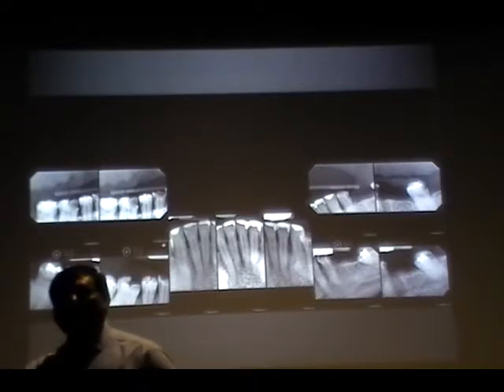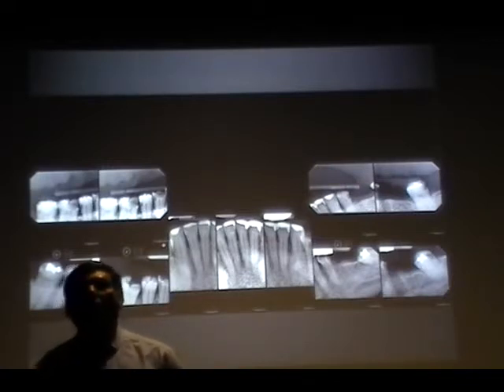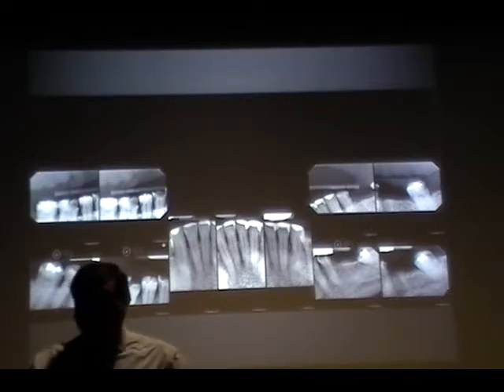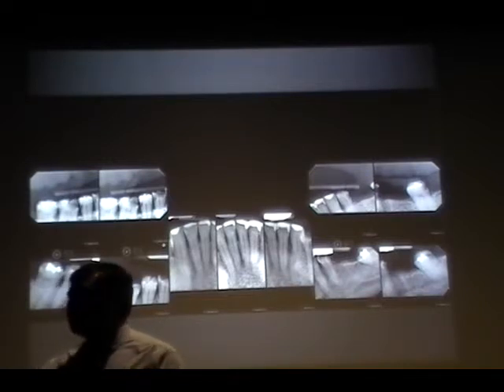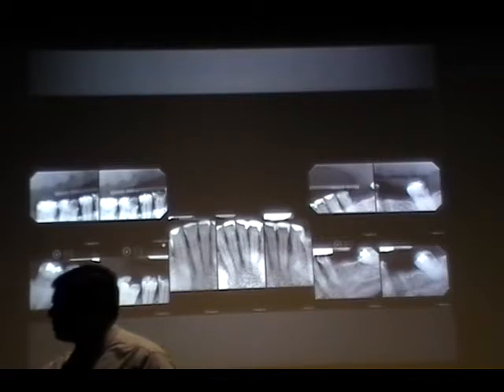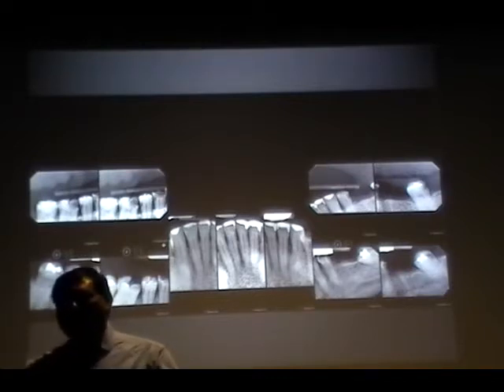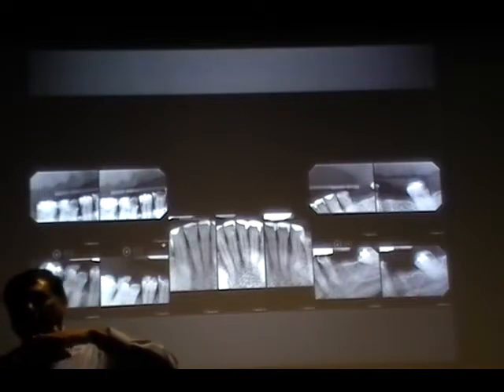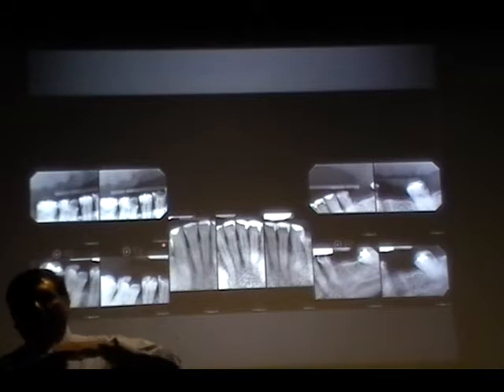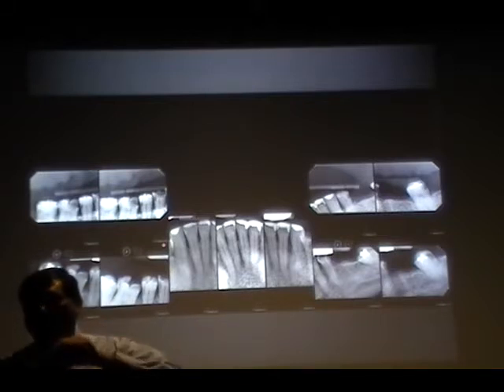Do you ever place the bite block on the gum, or do you always have to place it on a tooth? We'll try to place it on the tooth, and if there is only alveolar ridge and no teeth, then we don't have any other choice. Yes, we could use a cotton roll to support, because on the alveolar ridge it's really hard to stabilize the bite block. So you use a cotton roll to stabilize. You place the cotton roll and place the bite block as the patient bites. Okay.